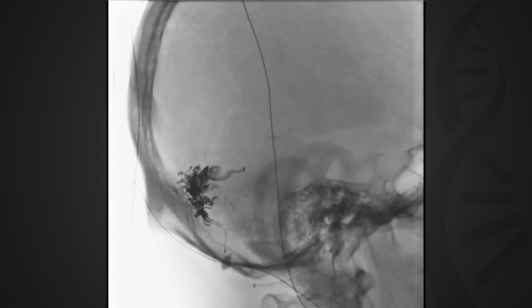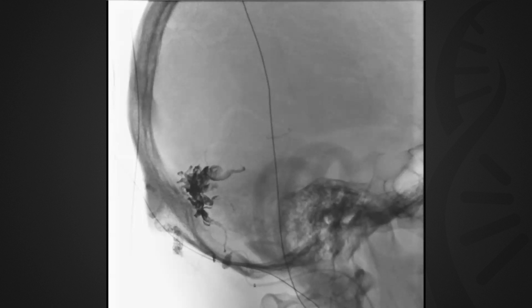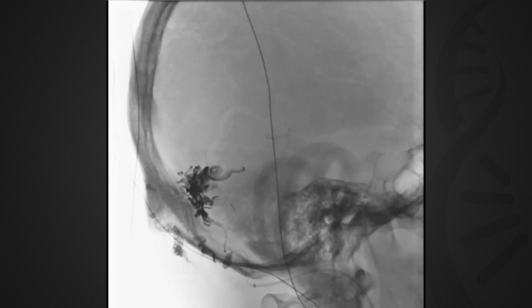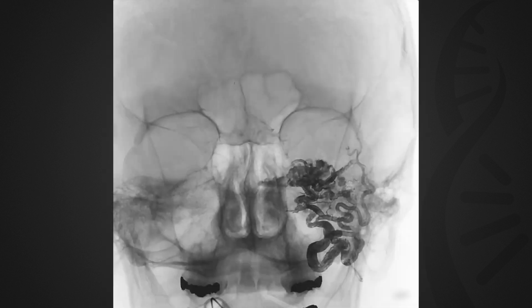We undertook a trans-arterial approach once again involving the left external carotid artery branches. The patient was fully heparinized. Using an intermediate catheter for support, we navigated a microwire through a dual-lumen ONYX-compatible balloon catheter into a branch of the occipital artery. With the balloon inflated to prevent reflux and to enhance the potential for the ONYX to penetrate into the fistula, we were able to further embolize the fistula with ONYX-18.